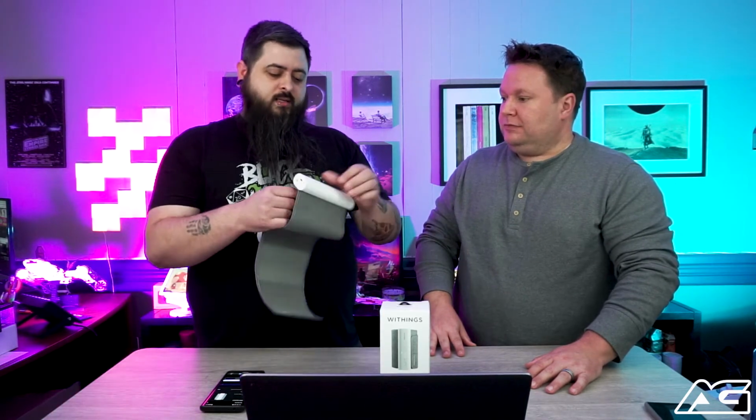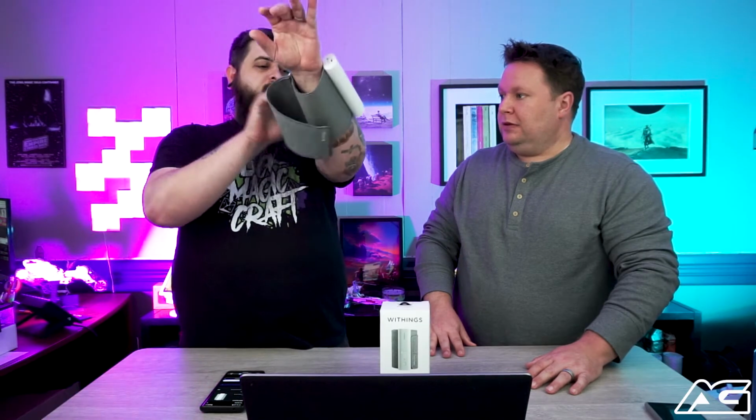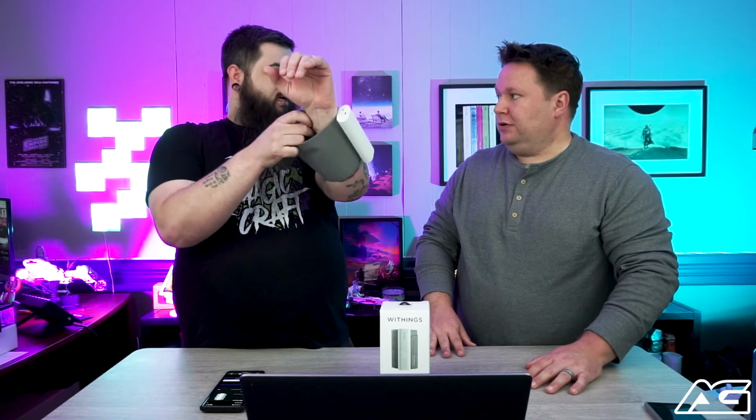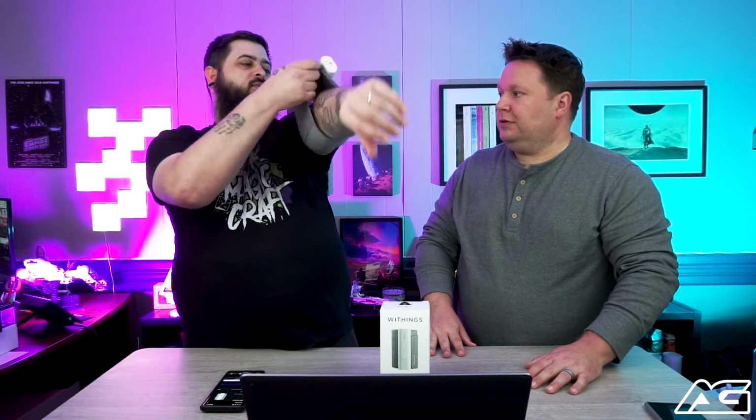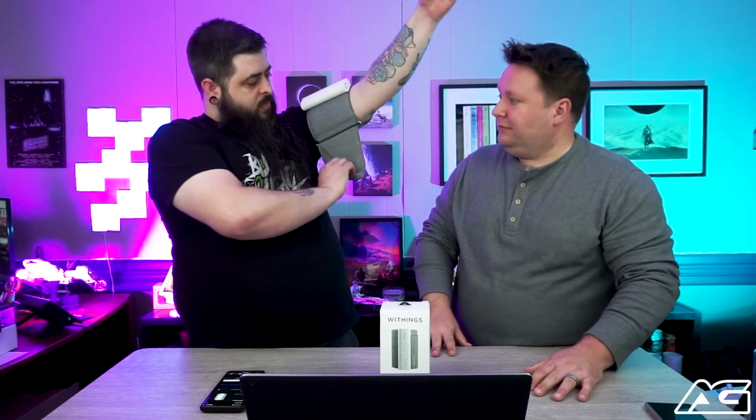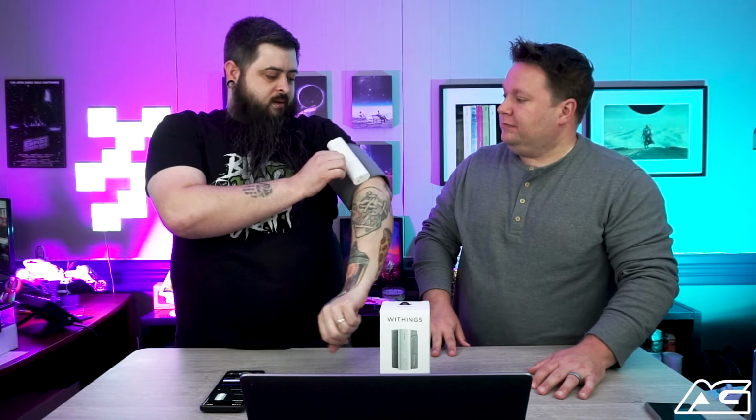Now, when you run it, does it feel the same as going to the doctor? It does. It's actually surprisingly tight. When I put it on, I didn't cinch it super tight, because I knew it was going to have to give some. So I just pulled where it was snug, and then you just hold and press the button and it starts.